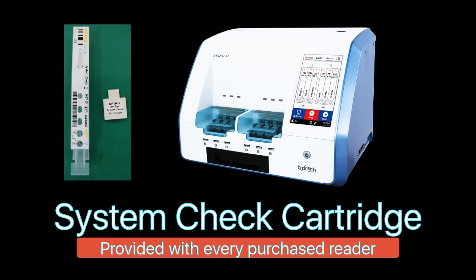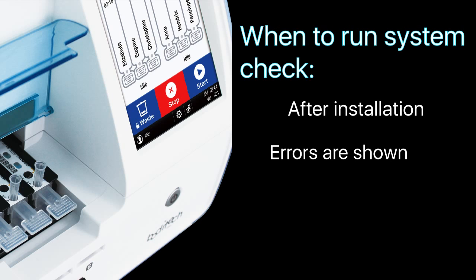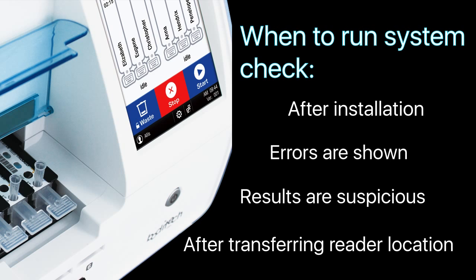Now let's run the system check cartridge. The system check is usually run after every reader installation, whenever test errors are shown or results are highly suspicious, or after the reader was transferred from one location to another.